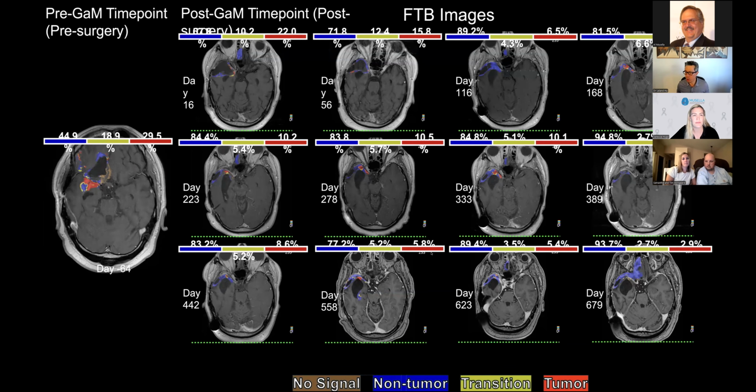And so to alleviate that concern, there was a group of researchers, myself included, as well as Kathleen Schmainda. The paper was actually headed by Dr. Jerrold Boxerman at Brown, but we all got together, put all the evidence together, and came up with recommendations of how to perform the DSC perfusion.